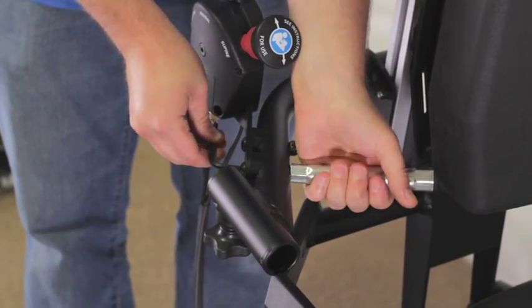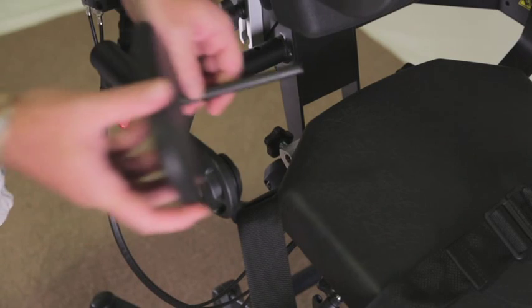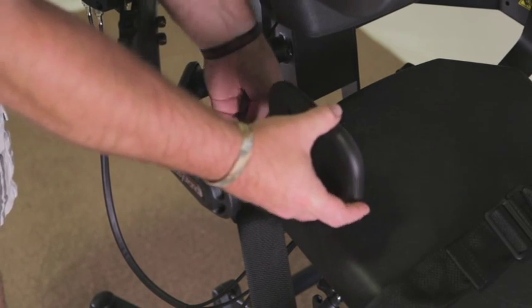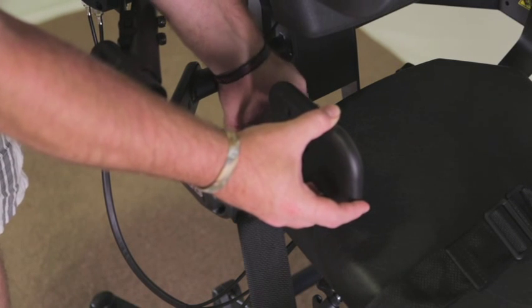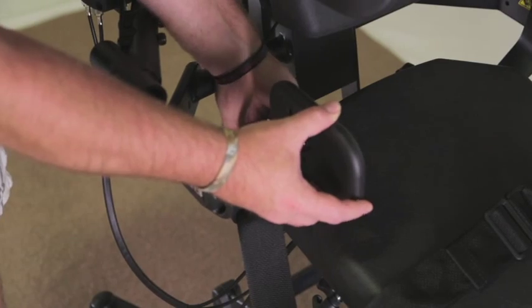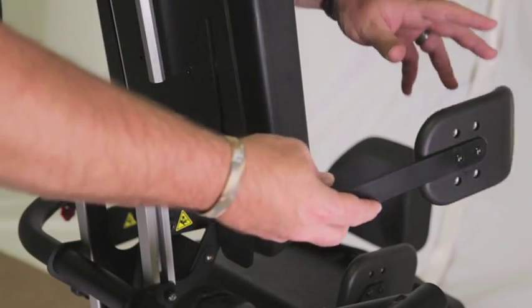Tighten knobs securely. Place hip supports behind the seat as shown and tighten knobs securely. Place lateral supports onto the back as shown.